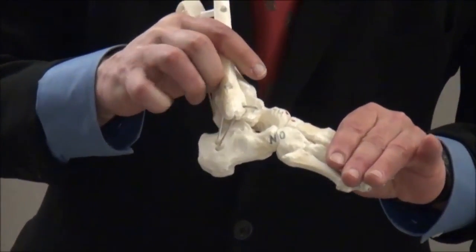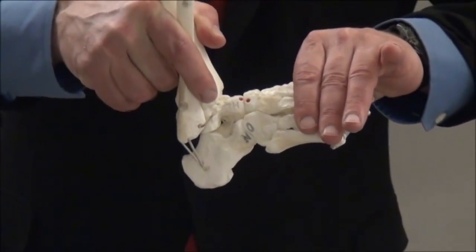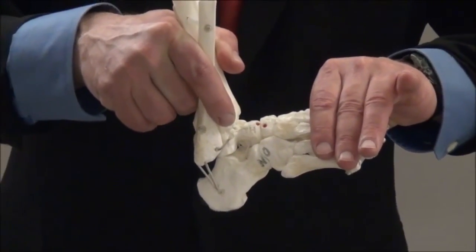The final step of the Ponsetti technique is usually a tenotomy to eliminate the ankle component of the equinus.